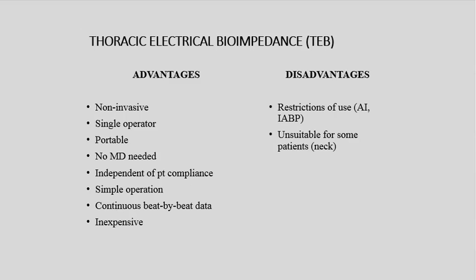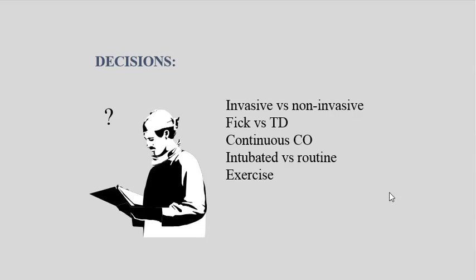Now that covers our non-invasive technology, and I'm pleased we split the lectures into 2. This has taken a full-length lecture, but the big choice any doctor has to make who wants a cardiac output is deciding on the methodology he prefers to use. First, is it likely to be invasive or non-invasive? What are the circumstances? Is it a hospital? Is it a clinic? What facilities are available?